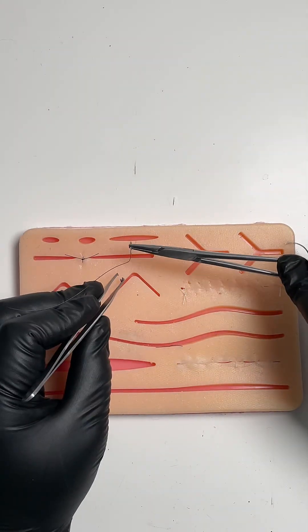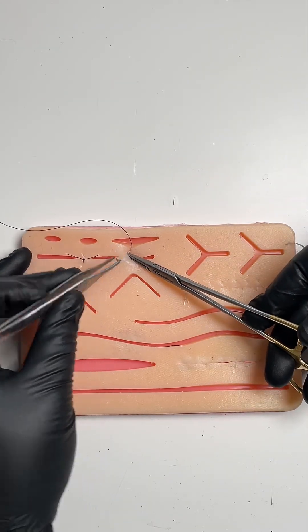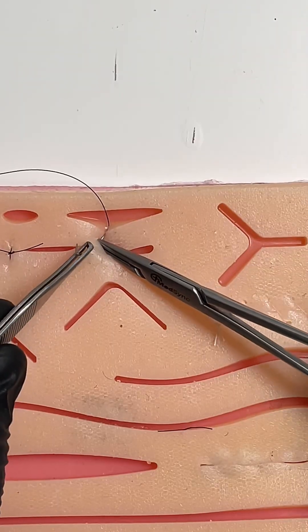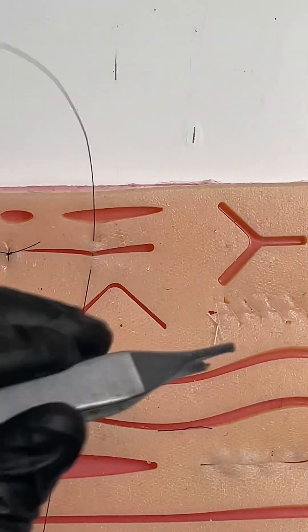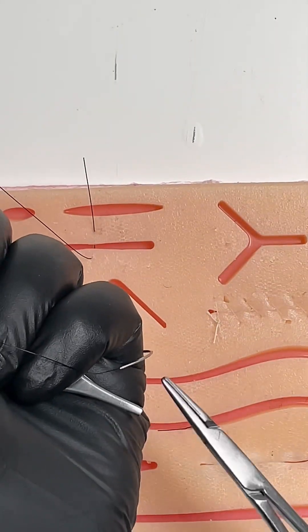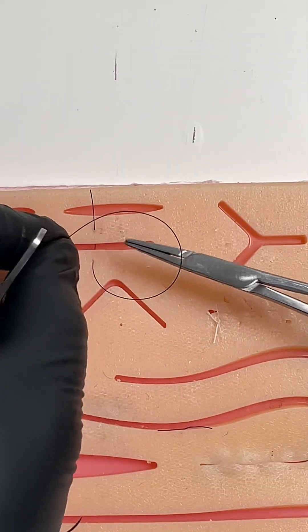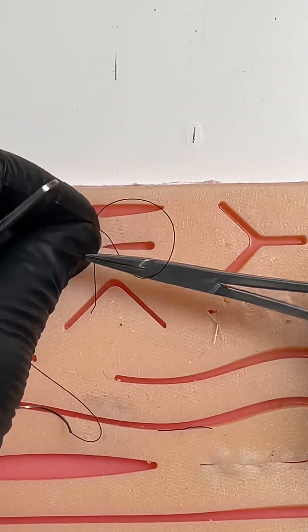Let me show you that one more time. Go across horizontally — not vertically, because chances are you'll miss if you go vertically. Go across horizontally and you can't miss. Grab it with the forcep, palm your forceps. I leave the needle here — it's not in my hand, it's not going to help me; when I turn my hand it lays there, I've always got it. Leave a short end and push forward — that's half the loop for you — one, two, your finger, and one.